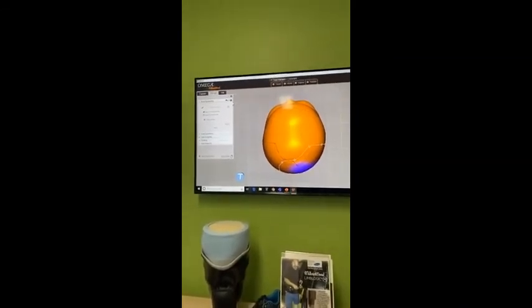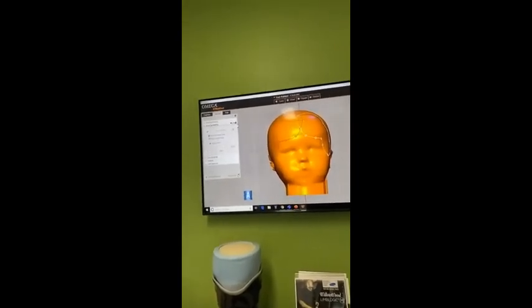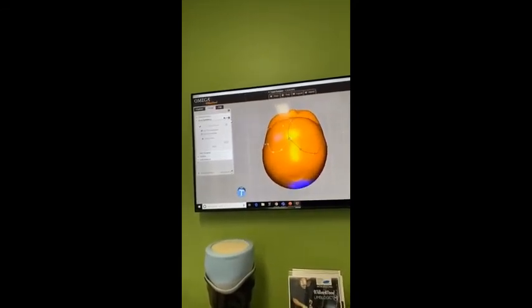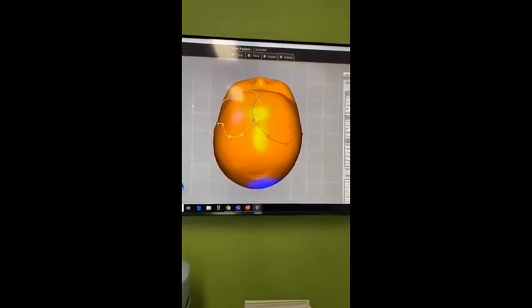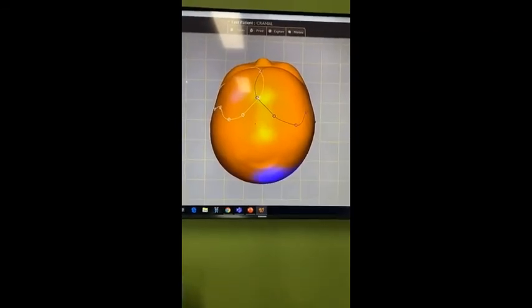So we use these area symmetry tools. So for the front, again, we copy the high point side and mirror it over to the other side to create a high point on that side to allow the skull to grow into that void.